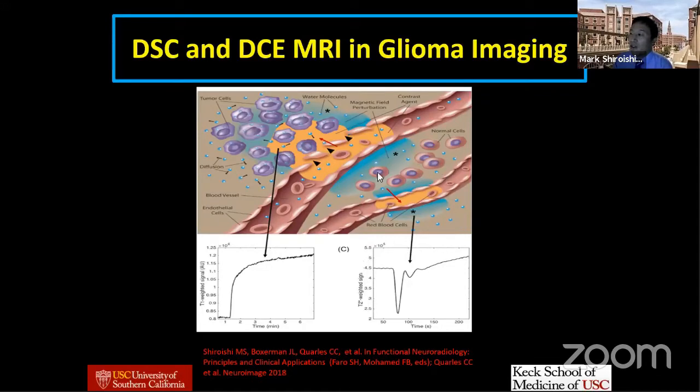This is also the basis of perfusion MRI that we do for the other major application of perfusion MRI, which is stroke imaging. And basically, this yellow is the contrast agent, the dye. And what you're assuming is that the contrast agent dye, the biophysical model that was developed many, many years ago as the basis for perfusion measurement using this technique, is predicated on the idea that the contrast agent stays within the microvasculature, stays within the capillaries, and we're measuring perfusion at the small vessels.